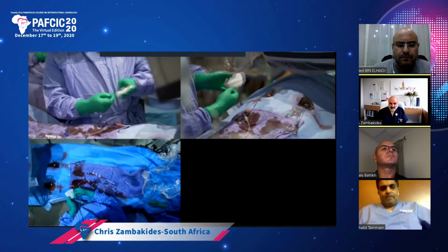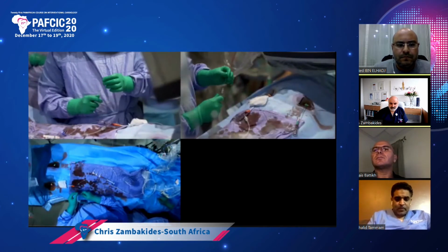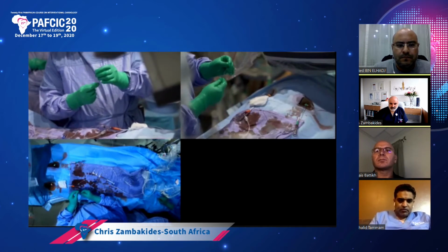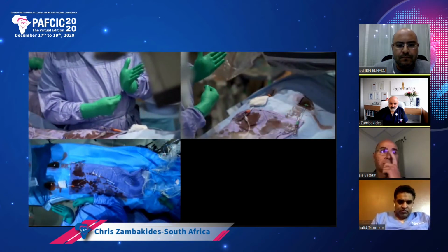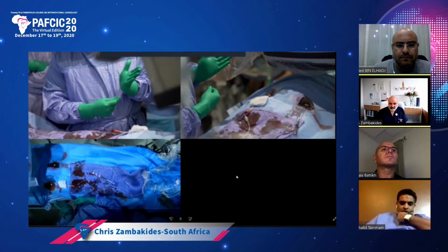And remember, once you're in the septal and you're in the microchannels, the microchannels will straighten the secondary bend, and you're going to be left with your primary bend, which is only about 1 or 2 millimeters, to then do the septal surfing and try and cross the septals into the right coronary artery.